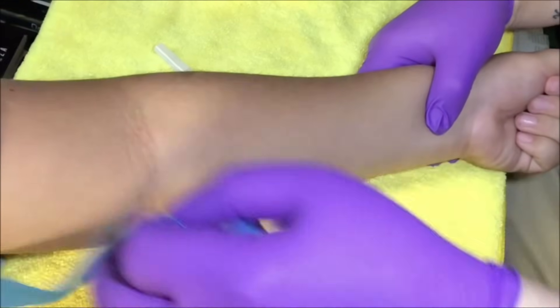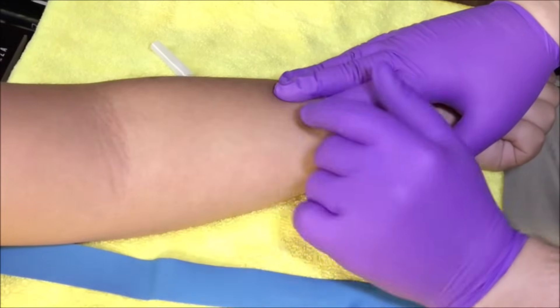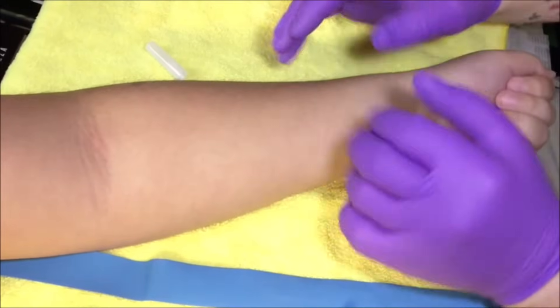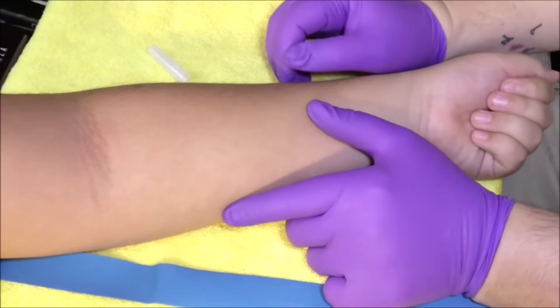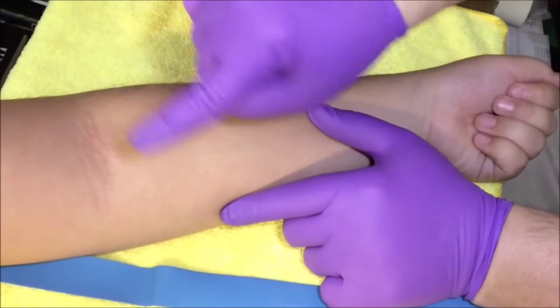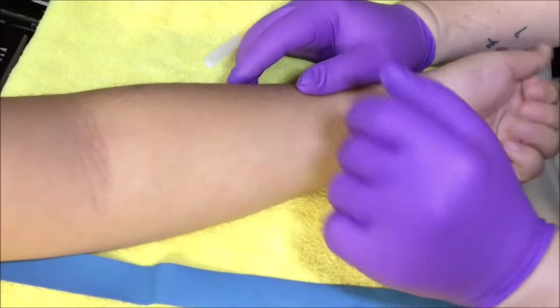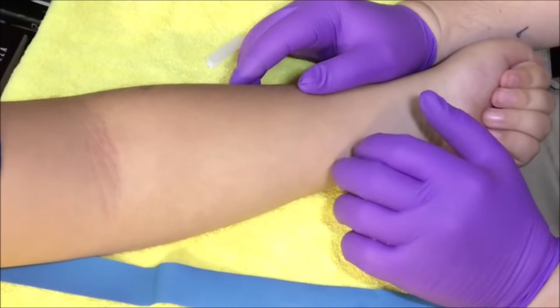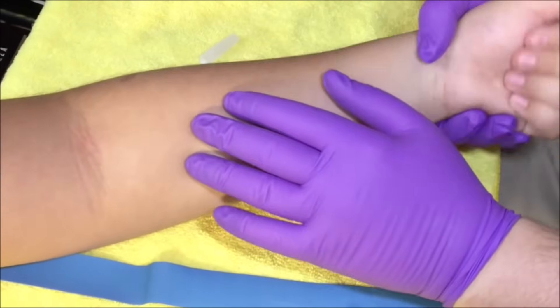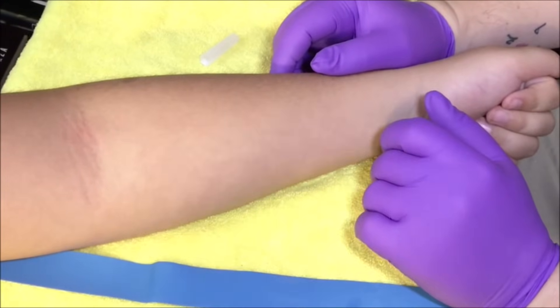Once I've marked the site, I can release the tourniquet. When I'm ready to draw, I'll put the tourniquet back on and relocate my vein, remarking it if needed, using the bending of the elbow technique. Once I find it and mark it, I go ahead and draw right where I marked it. Push down first, then alcohol the site — once you alcohol, you can never re-palpate, because your gloves are not sterile. Locate the three major veins using the bending and twisting technique, mark the site, alcohol, then do your draw.